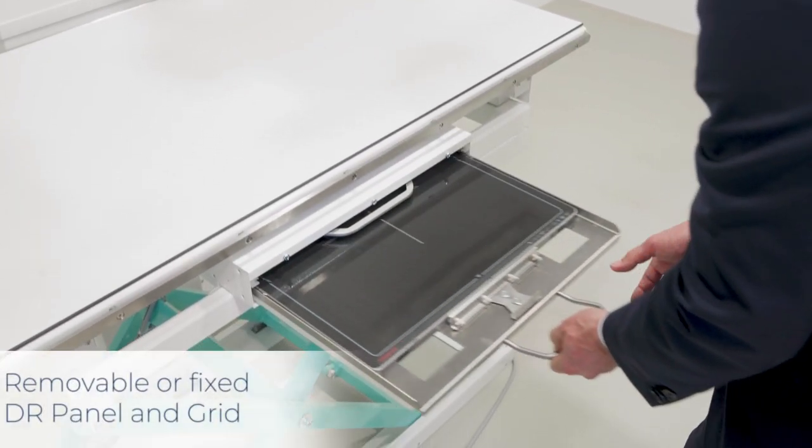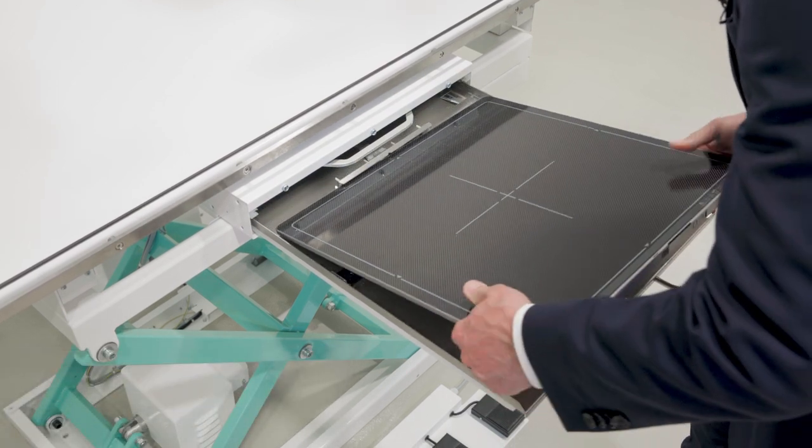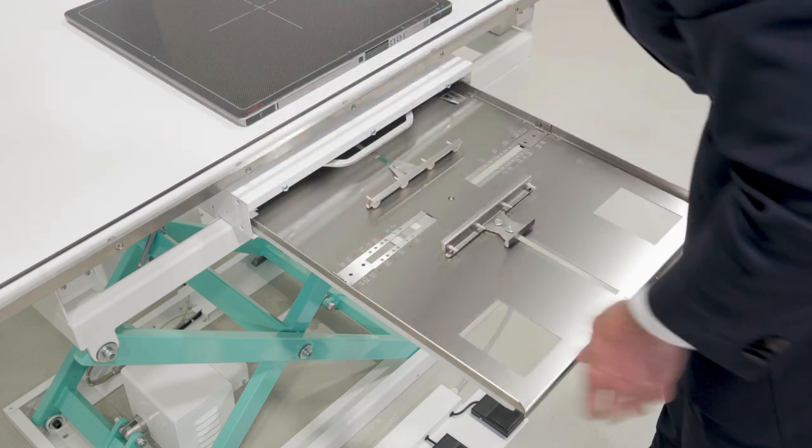The integrated crash guard sensors ensure safe operation. Moreover, it features a grid cabinet for standard cassette sized Wi-Fi or fixed DR panels, and can be configured for either fixed or removable grids.